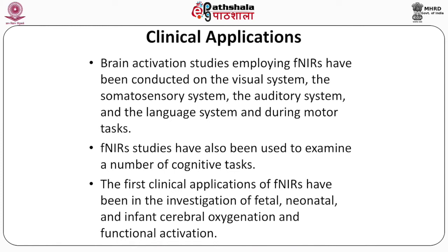Brain activation studies employing fNIRS have been conducted on visual systems, the somatosensory systems, the auditory systems and the language system, and during some motor tasks also. So these are certain parts of the central nervous system that are studied using this technique. fNIRS studies have also been used to examine a number of cognitive tasks.